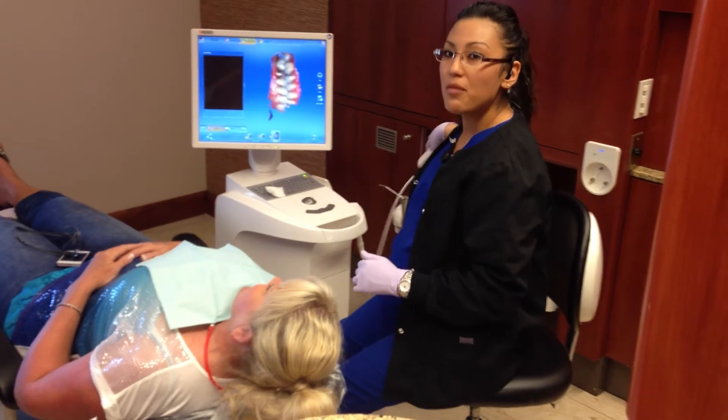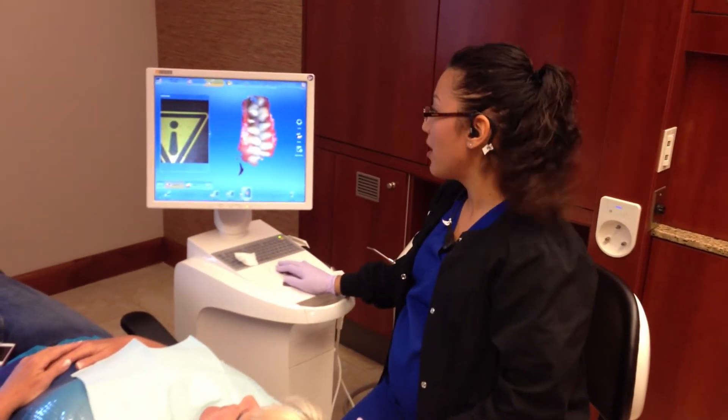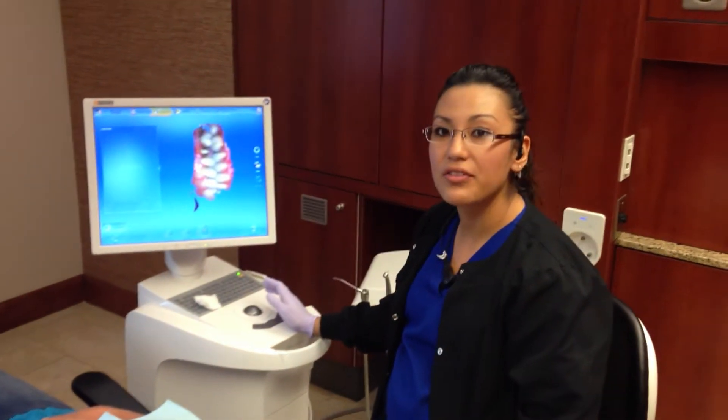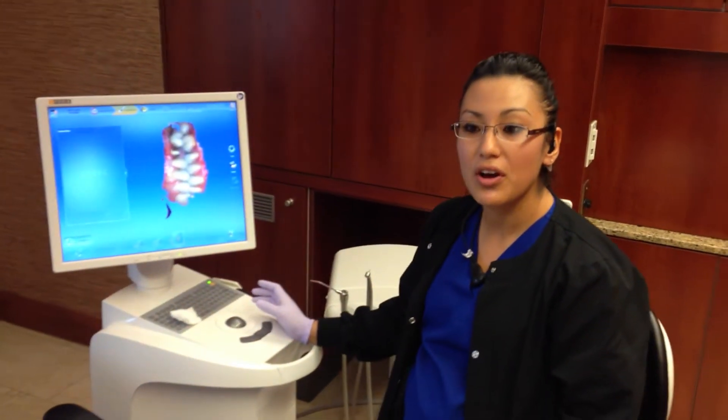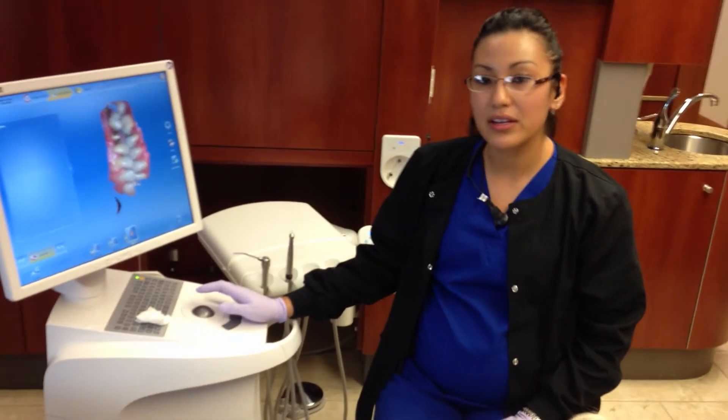This is our Omnicam, our way of taking digital impressions for our crowns. We no longer have to use any impression material. We're not really gagging the patients. It's just a live read that we run the camera over the teeth. It's very quick and simple.